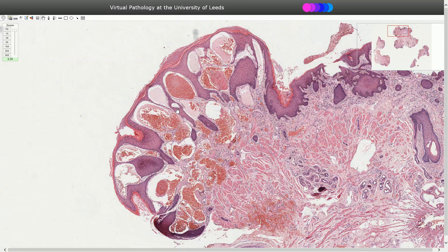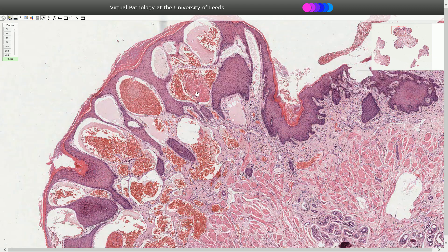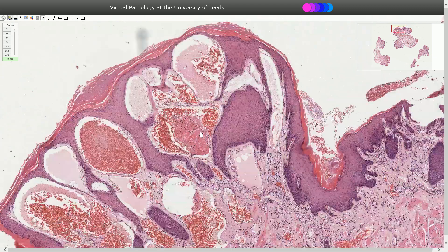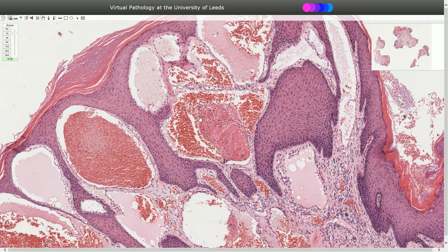Sometimes we can see thrombosis inside of these blood vessels, as in this case. Here we can see the fibrin and red blood cells — this is thrombosis.